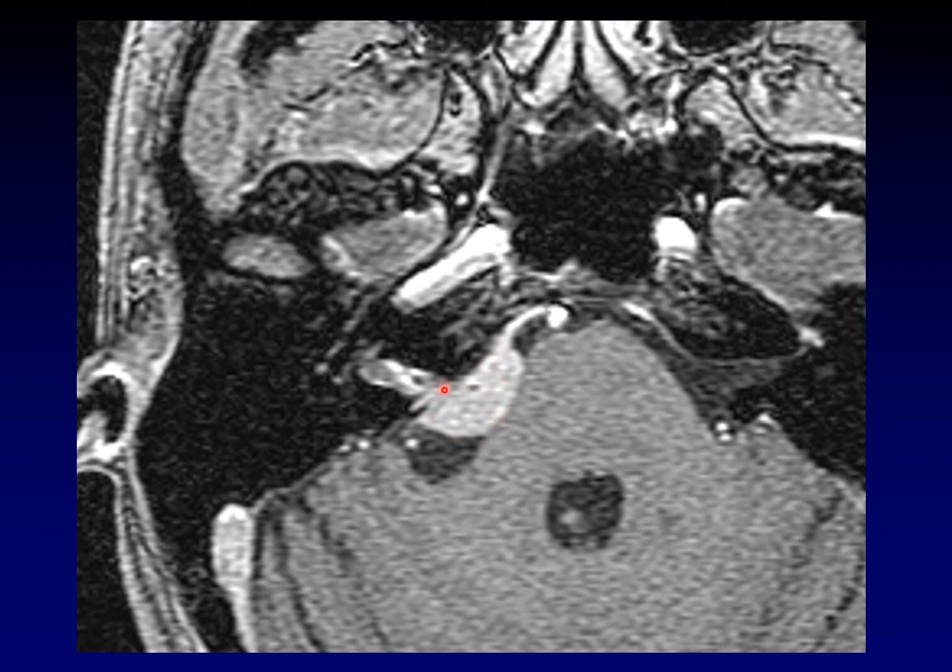Now, the tricky thing here is, what about this enhancement in the internal auditory canal? At first glance, it looks like this tumor is just sort of covering the porus acusticus, but why is there all this enhancement in here? The answer is that this is neuritis. The nerves that have been crushed as they try to get around this meningioma are irritated and enhancing, so that's why we're seeing the enhancement along those nerves. Now, meningioma can turn the corner and enter into the internal auditory canal. It's not impossible. All of these features are just guidelines. What do you do when you run into a mass that has both types of features?